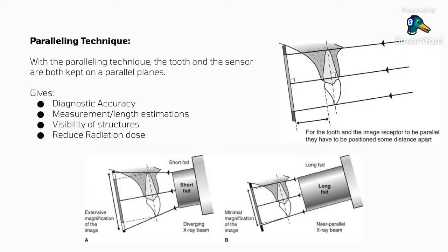All right. And of course, many of your X-rays will not be perpendicular, making a 90-degree angle with the film, which we want, which is the whole point of the paralleling technique. So this is one of the principles that we discussed previously by Manson and Lincoln, that you should have a long FSD, a long focal spot to film distance. This will make sure that the X-rays go parallel, and when they travel parallel for as long, and the film sensor is as close to the tooth as possible, it will reach the film sensor before it can diverge, and it will make the 90-degree angle with the film, and it will give you a very good, crisp, clear X-ray that you can make the diagnosis from.